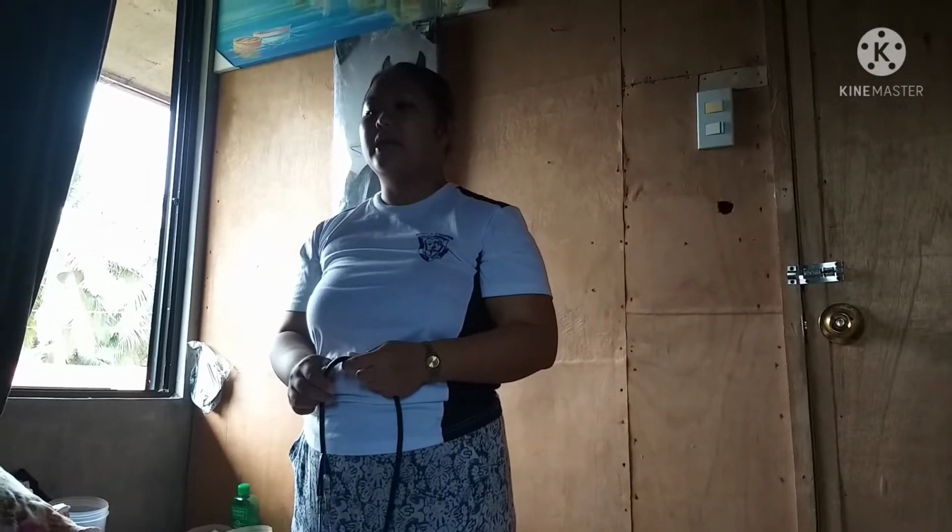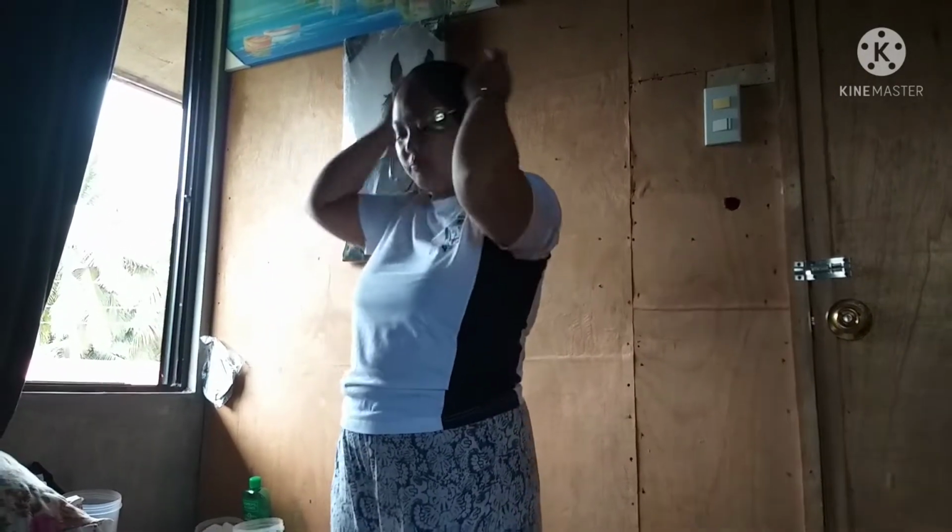Raise the gown and properly drape the client, exposing the sternum and the left side of the chest. This allows access to the patient's chest for proper placement of the stethoscope.